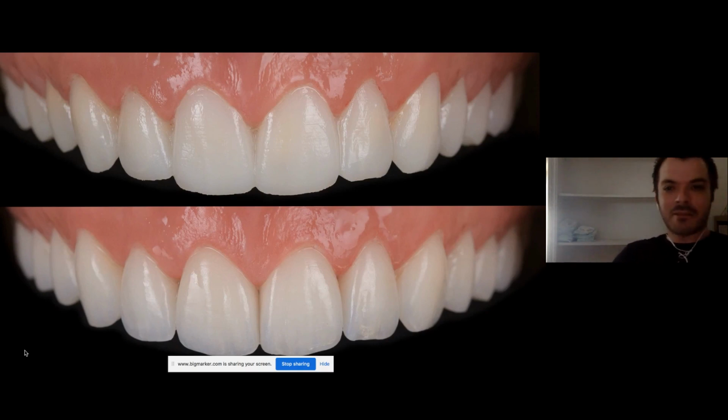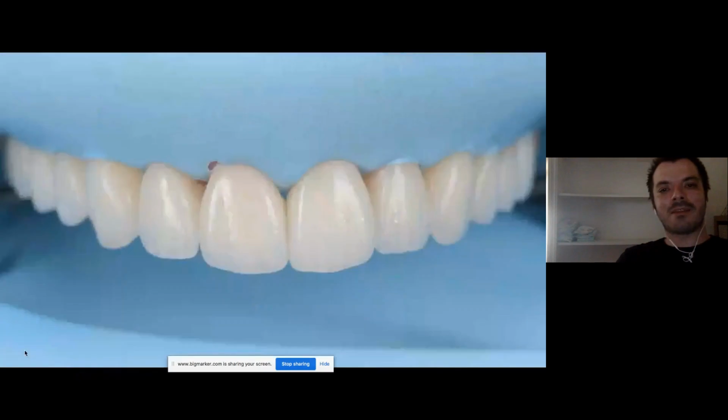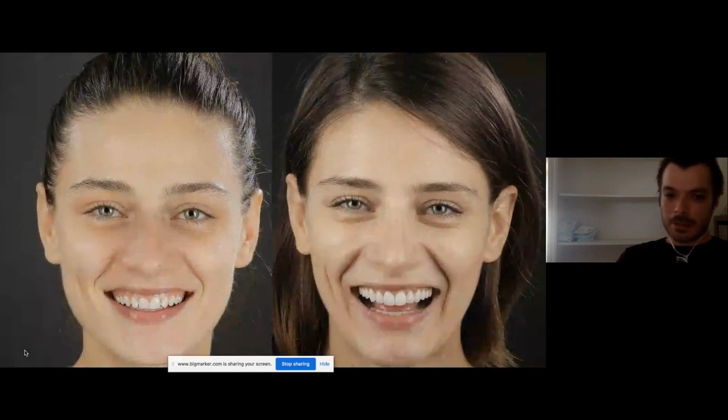It doesn't matter because at that point, the morphology being on top of tissue, there is no relevance of anything else but relation to the face in first step and acceptance. Once you get acceptance, then you go in a dental software, and then you have to put everything together with the interarch relationship, planning, how much you have to reduce and this type of things.